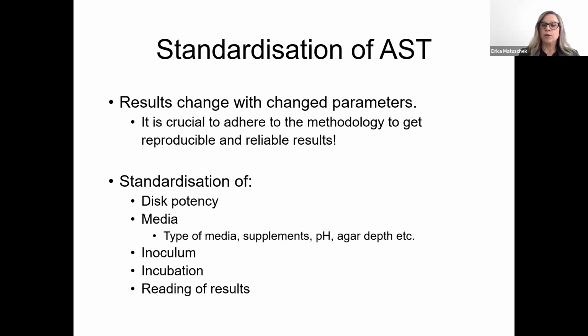So in the disk diffusion method, we have standardized the disk potency, the actual amount of antibiotic that you put into the disk, the testing media, both the type of media, but also supplements, pH, and the agar depth. We have standardized the inoculum, the size of the inoculum, incubation time, atmosphere, and temperature.